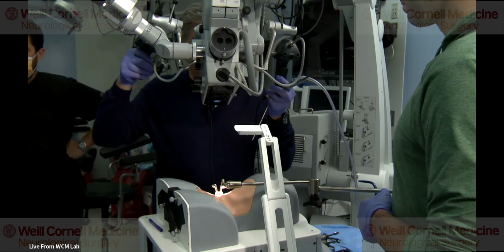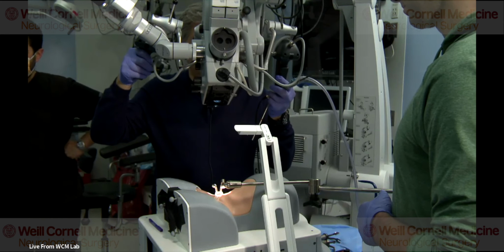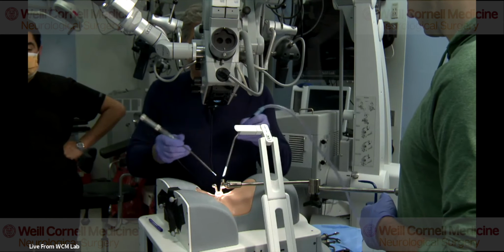Still in focus for you? Yeah, okay. So I start drilling typically medially at the inferior edge of the cranial lamina. I put the drill bit on the ligament and I go cranial.